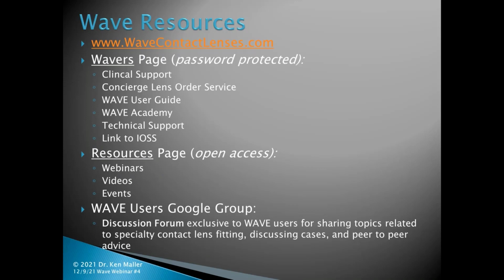That really is an artistic decision when I'm designing a lens. There are a lot of things that I will weigh out. If the fit is too compromised for the vision, I will sometimes throw the vision under the bus, because I'm not going to get the lens to perform right in terms of malpositioning or comfort problems or whatever the case may be. So, for example, in that last case, vision was not the top priority.